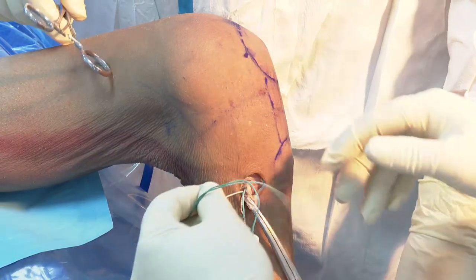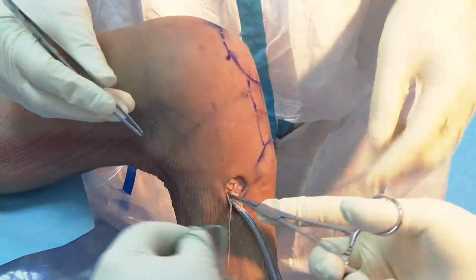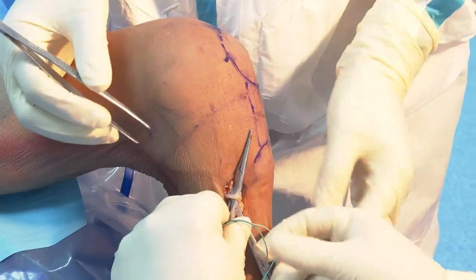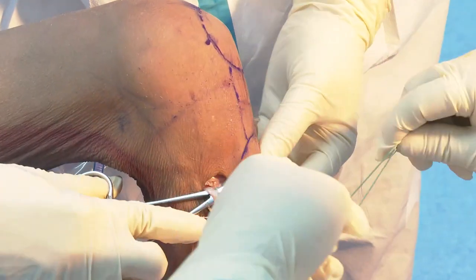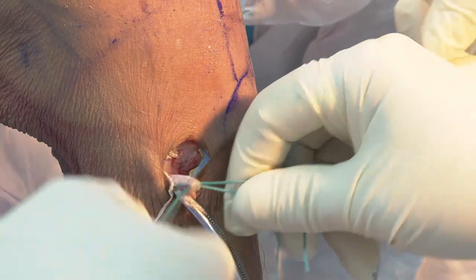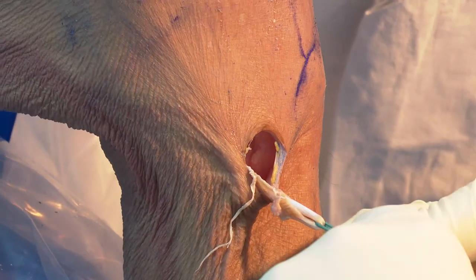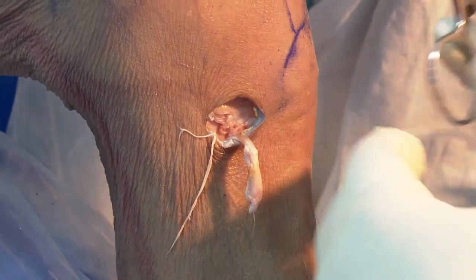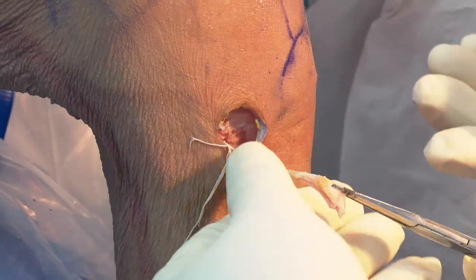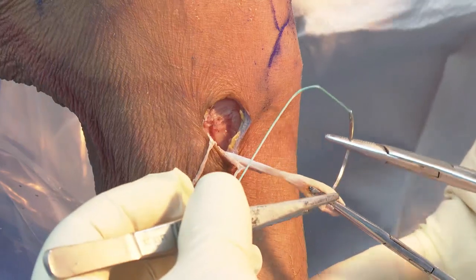So the next one, this is the semitendinosus. Okay. Now the semitendinosus handling. Semitendinosus, we do it the same way. It's similar. Okay, like that. So we get this and then we pull. Okay, you can use this. Just pulling. Don't worry. Okay, it will not cut, because you already detached the distal end. Okay, this is fine, no problem, the tendon will not break in the middle because its distal end has already been freed. Yeah. Okay, good. Like this. Then we suture the same way, with the same method.